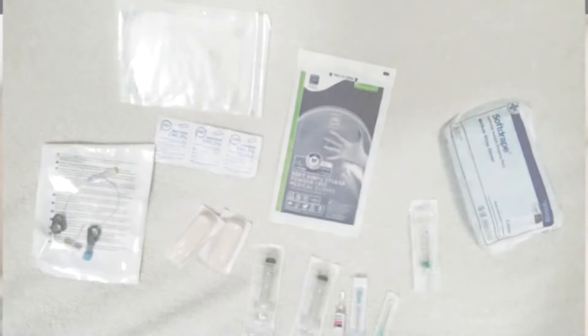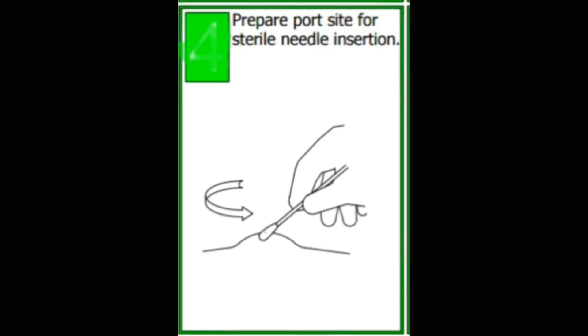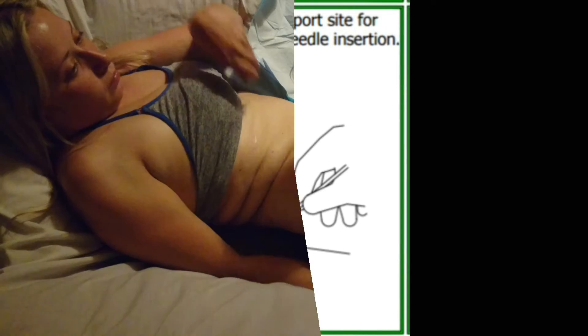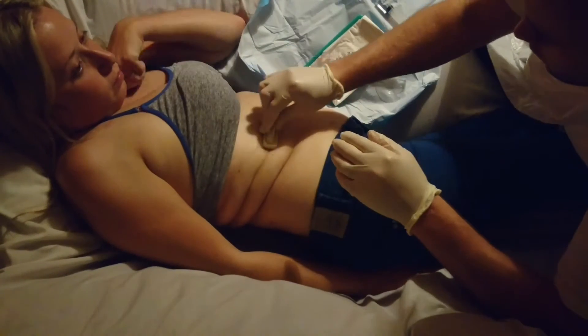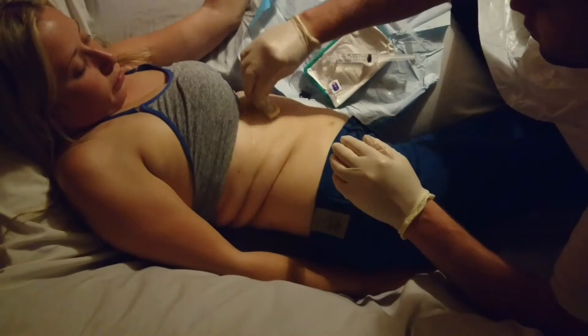Here is a typical kit for accessing and flushing a port. Firstly you need to prep the site for accessing, so it needs to be sterilised with a chloroprep or equivalent.